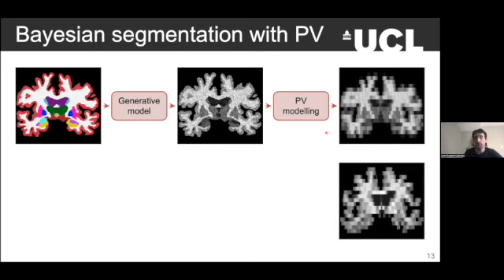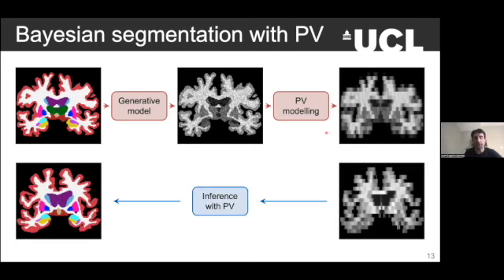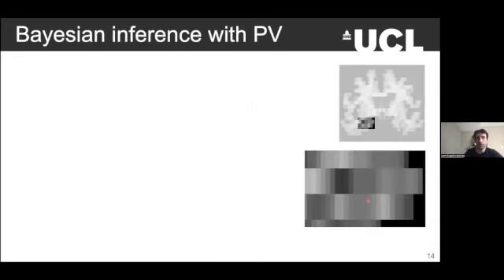And then you can play the same game and say, hey, can you do inference? It's just Bayesian inference, right? Why can't you do it? And then go back to a 1 by 1 by 1 segmentation from this guy. And it's not impossible. You can do it, right? Writing down the equations is very easy. Even writing the computer code is very easy. The problem is that this is a very, very complex problem.